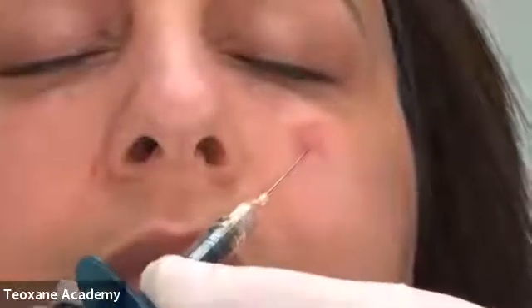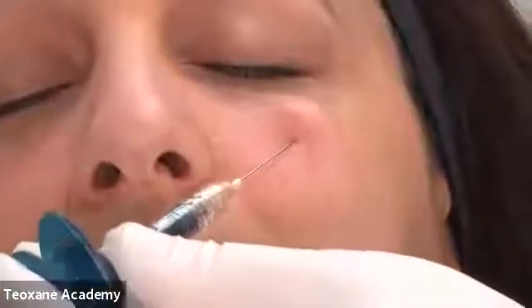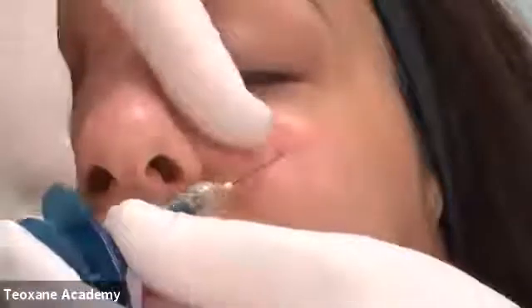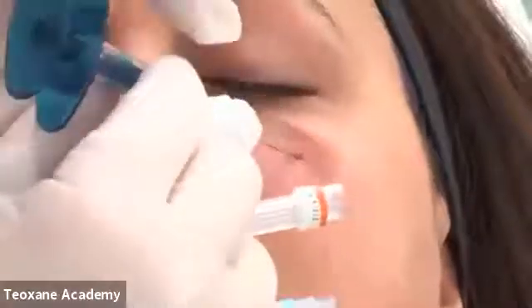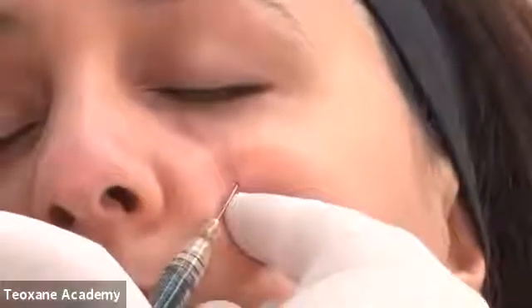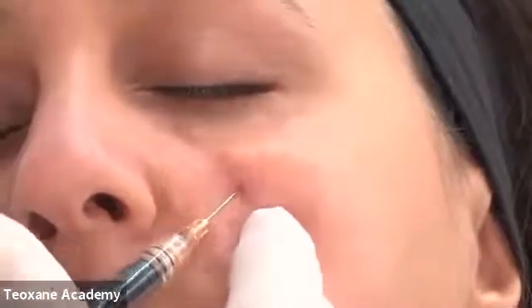And I will go in the palpebral malar groove. So you see I turn around and I'm going in the palpebral malar groove, deep on the bone. So I turn around my patient again because it's not the same axis. I turn the head of my patient a little bit and I'm going up just in the palpebral malar groove. I'm just here at the top and I'm going to inject slowly 0.2 ml of product to limit the depression in this area. So I put 0.2 and I will do a little massage at the end.